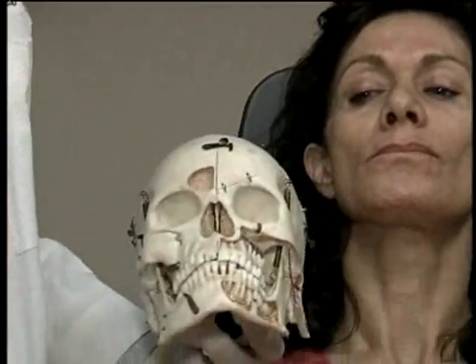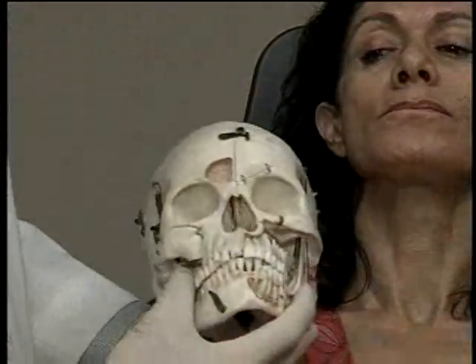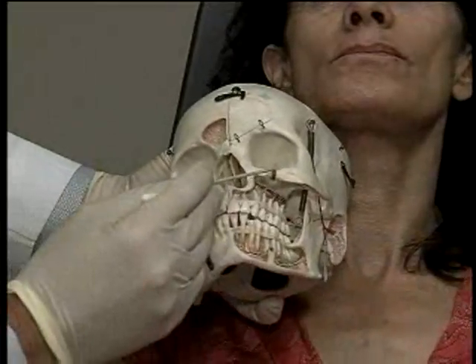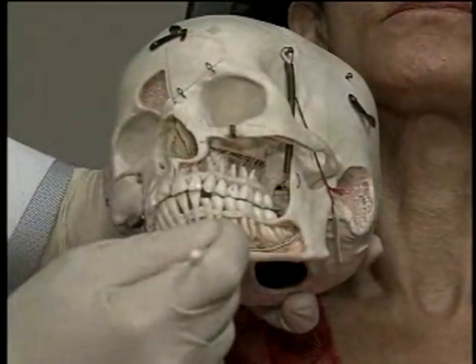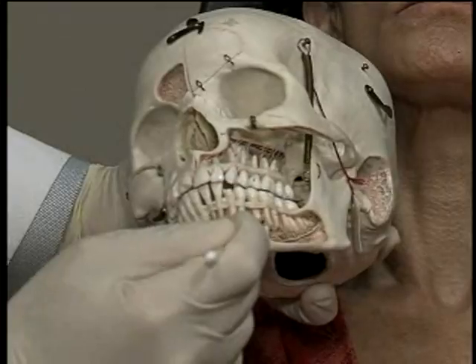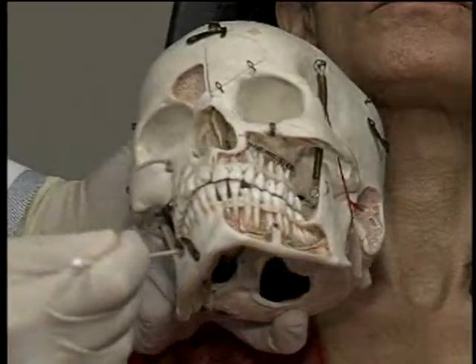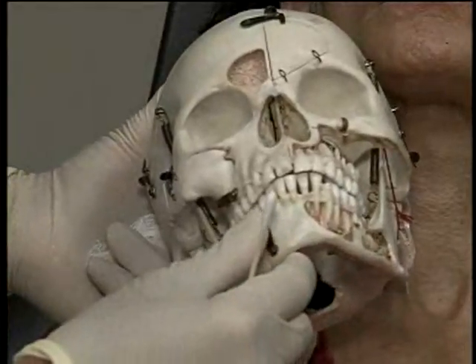You can see here on the skull, Q-tip. If you look on the skull, here's where the infraorbital nerve sits, the mental nerve sits. So I want to treat these as they come out of the foramen, but I don't want to inject in the foramen because there's risks with injecting into the foramen and intravascular injection, which I don't want.